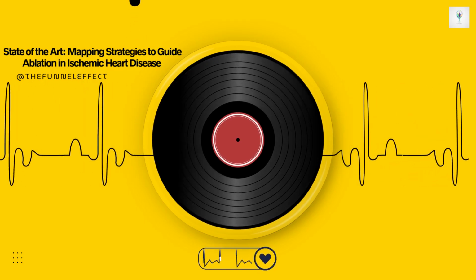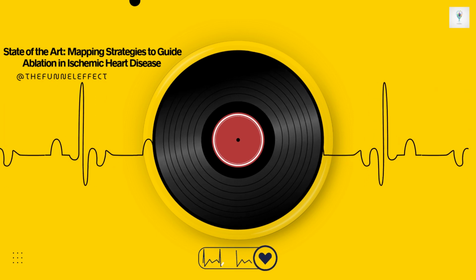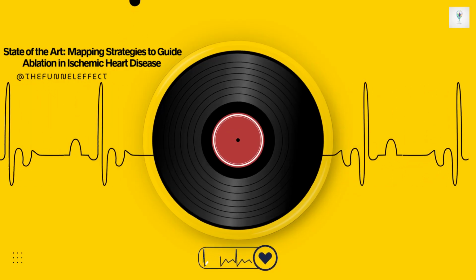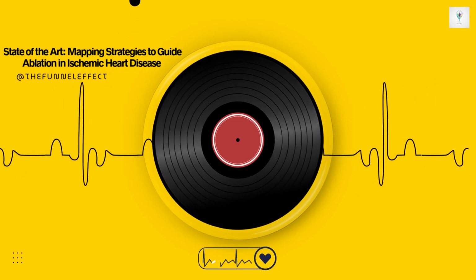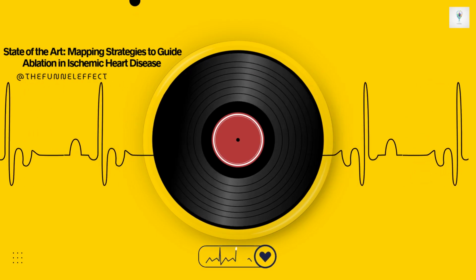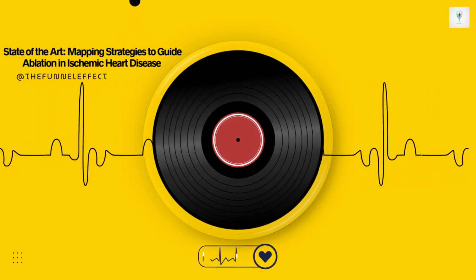Exactly. And the ultimate confirmation, of course, comes during the ablation itself. That's ablation termination. If, when you actually apply the radiofrequency energy, the VT terminates abruptly, and again, crucially, this termination isn't immediately followed by irritable ectopy, that is considered the most compelling evidence that you've successfully targeted and destroyed the critical isthmus site. Clinically, this finding correlates very highly with long-term freedom from recurrence of that specific VT.